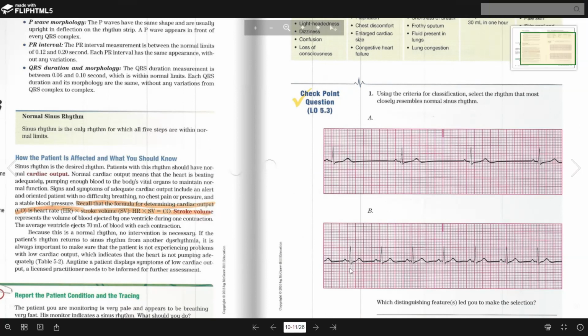And if it were to be irregular, we would use a 6 second. Correct. You count 6 seconds. So here we have 6 seconds. We have 15 large squares, 15 large squares. This is 6 seconds, okay? That's what we're looking at here. Let me see, 3, 4, 5, 6, 7, 8, 9, 10. Yeah. You have 30 large squares equals 6 seconds.